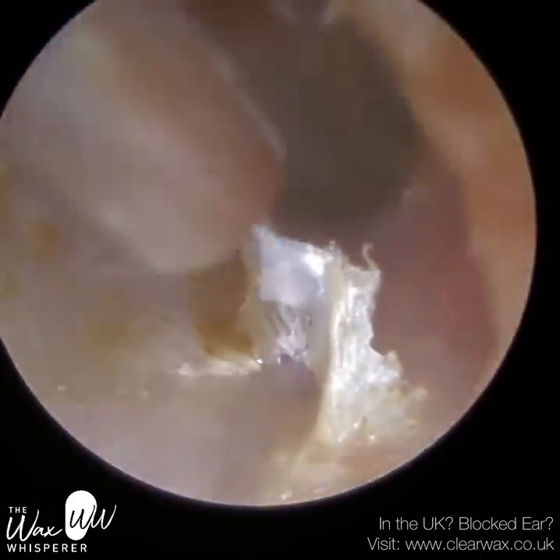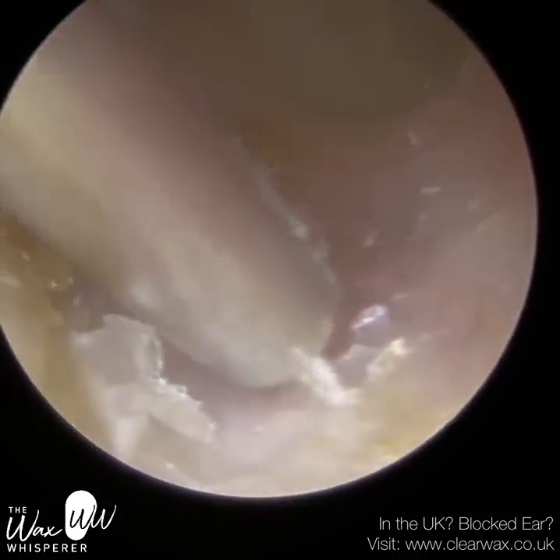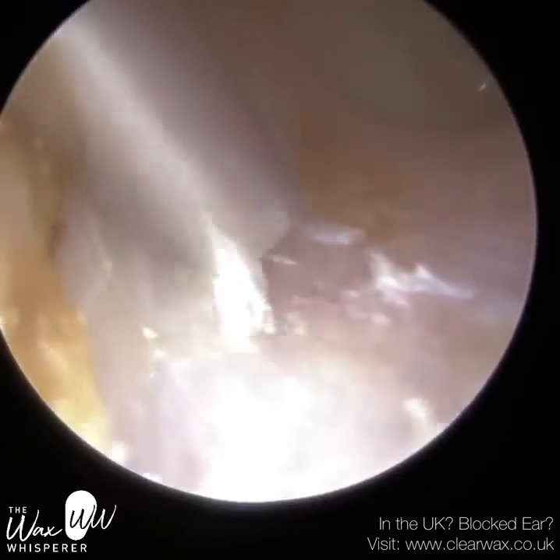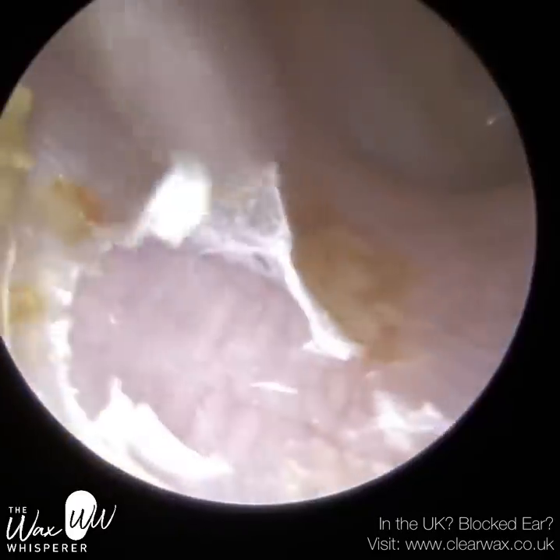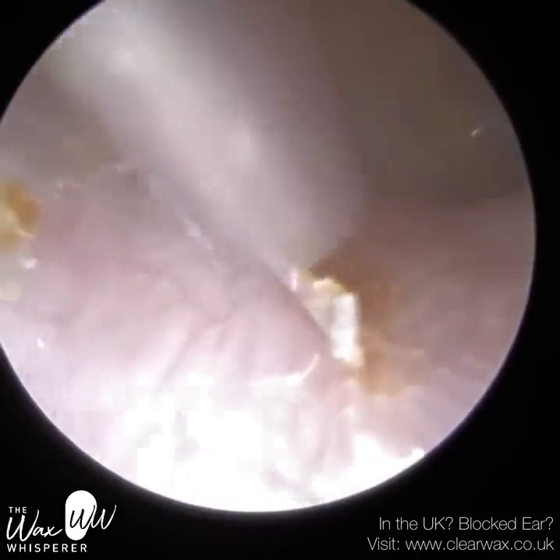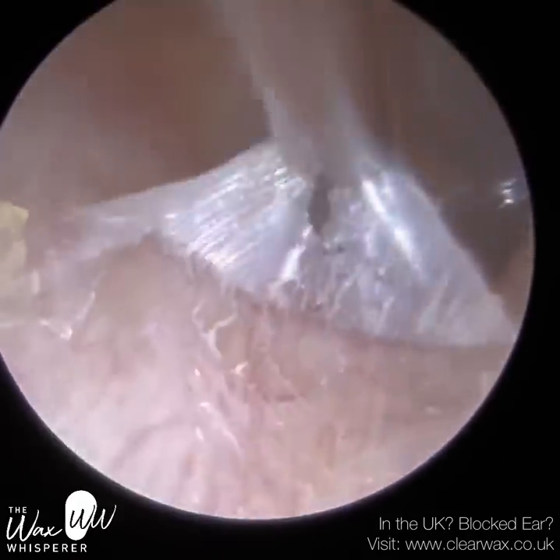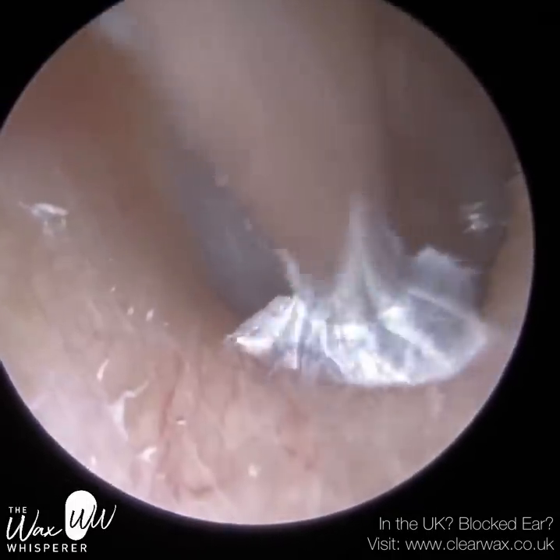The ear canal also takes on a sigma shape — the sigma is the S shape in the Greek alphabet — and it's got that curvature. I'm assuming that's an evolutionary benefit, having an S-bend in the ear canal, because it protects the eardrum. I had a patient yesterday — and I'll try to upload the video in the next week or so — they had the most severely bendy, twisty ears. It was incredible, almost like a chicane in a Formula One track. It was just incredibly bendy, and it's so hard to see the eardrum.